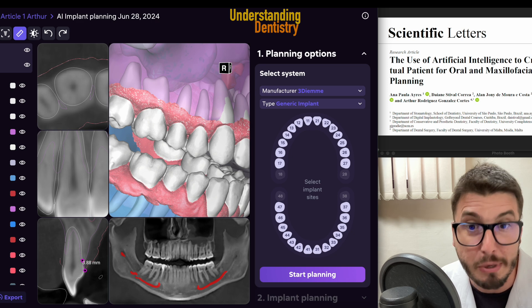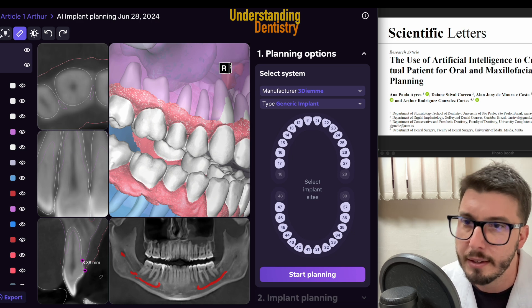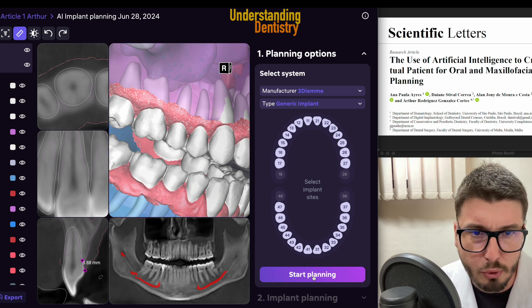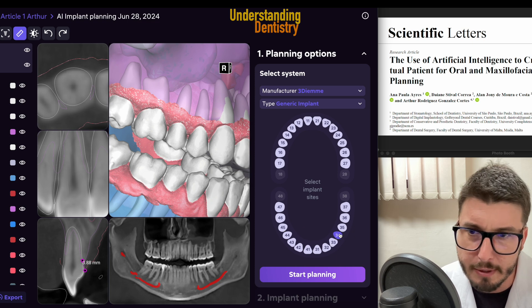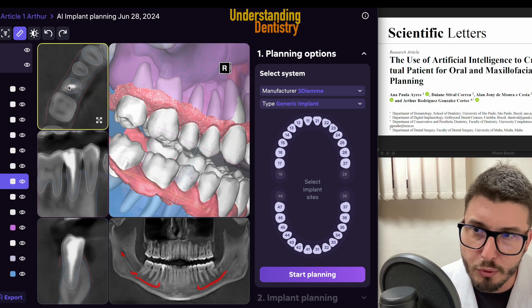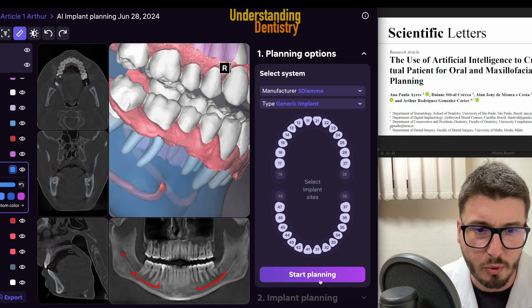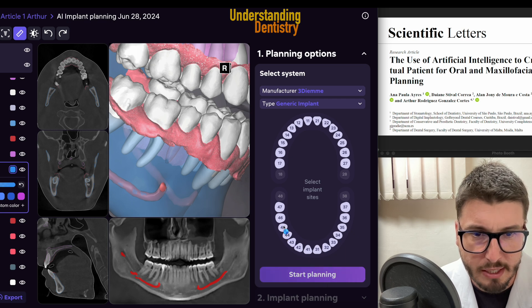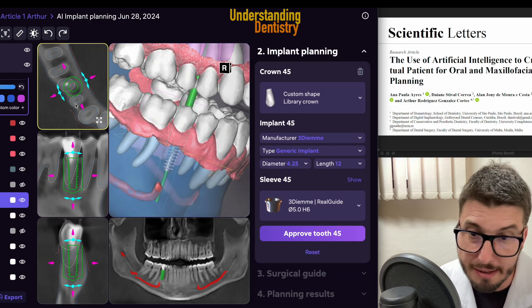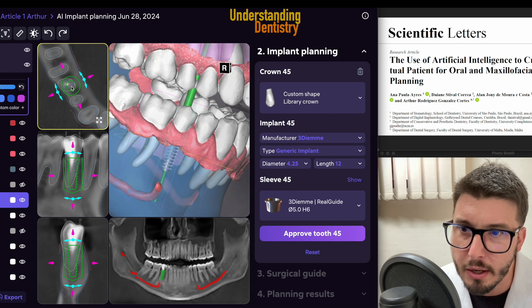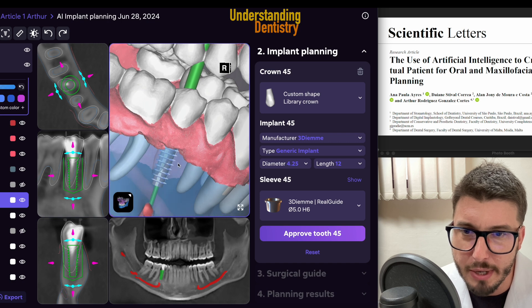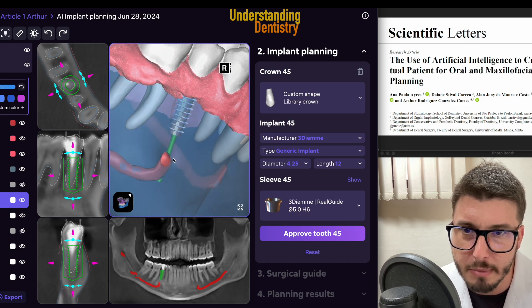It's very important to know these limits as biological width needs to be respected for a crown or for rehabilitation. Then we have the planning tools. We have a root canal treated tooth here — the four or five is root canal treated. I will select the tooth and start the planning. I already have an automated position of my dental implant, which I can adjust. I can confirm that my implant is far away from the mental foramen and the mandibular canal.